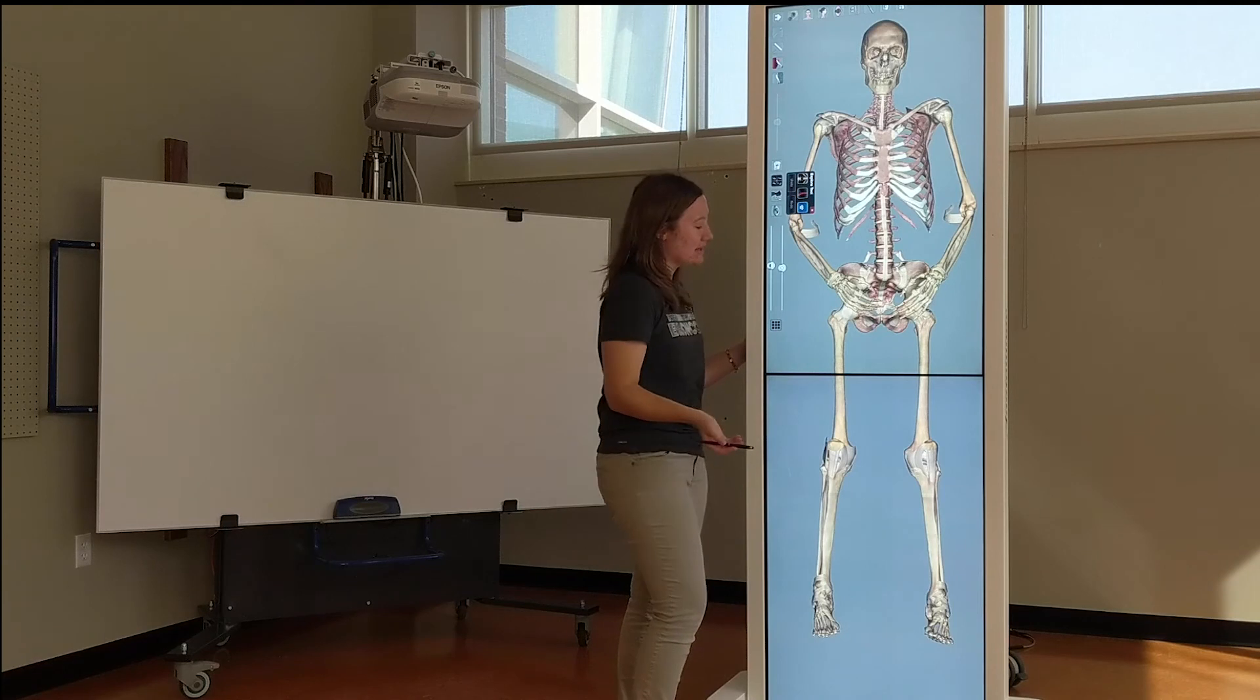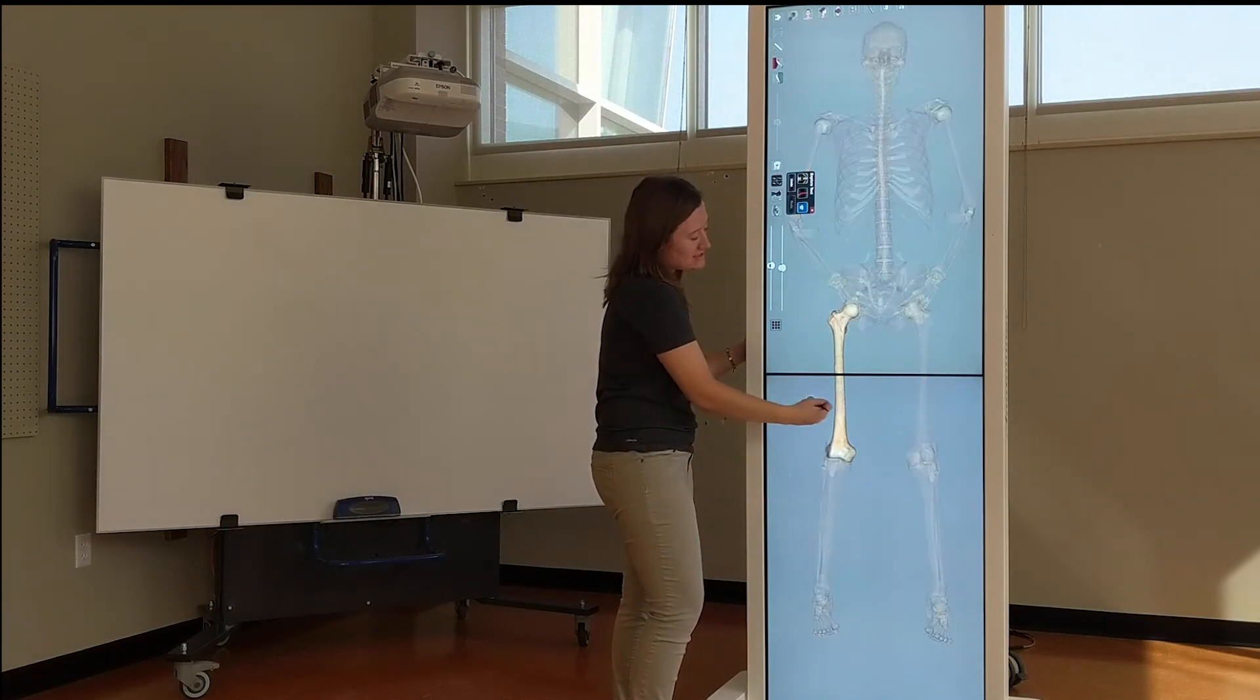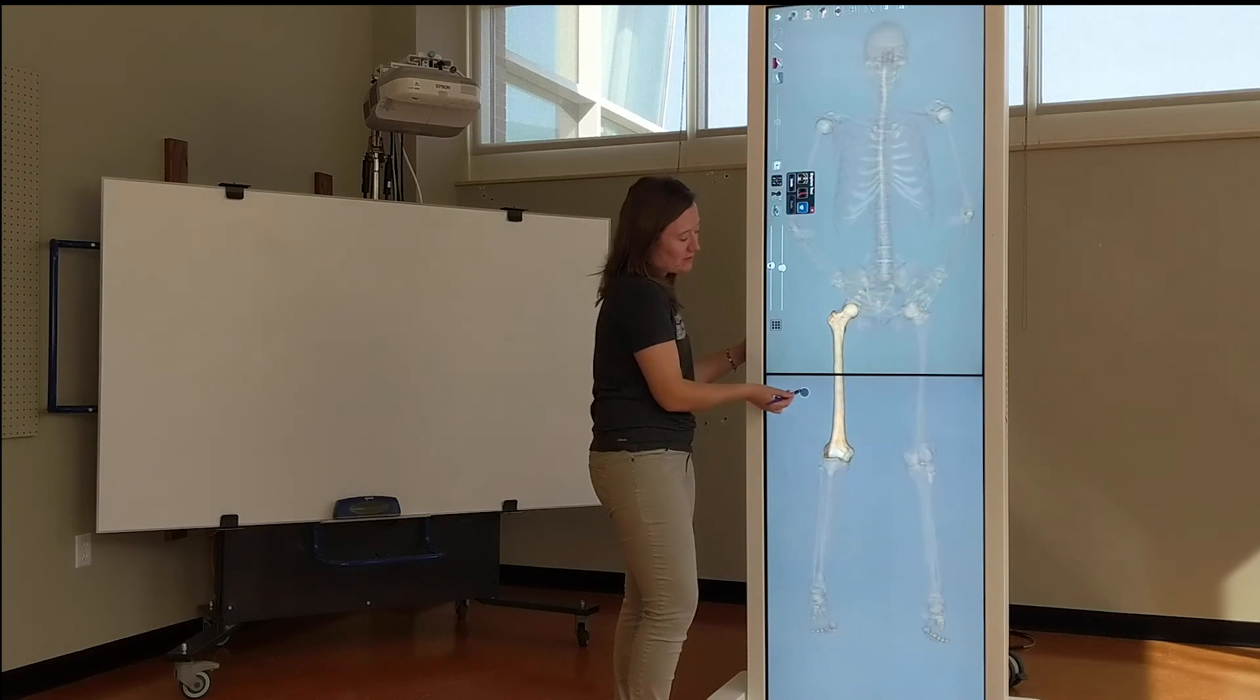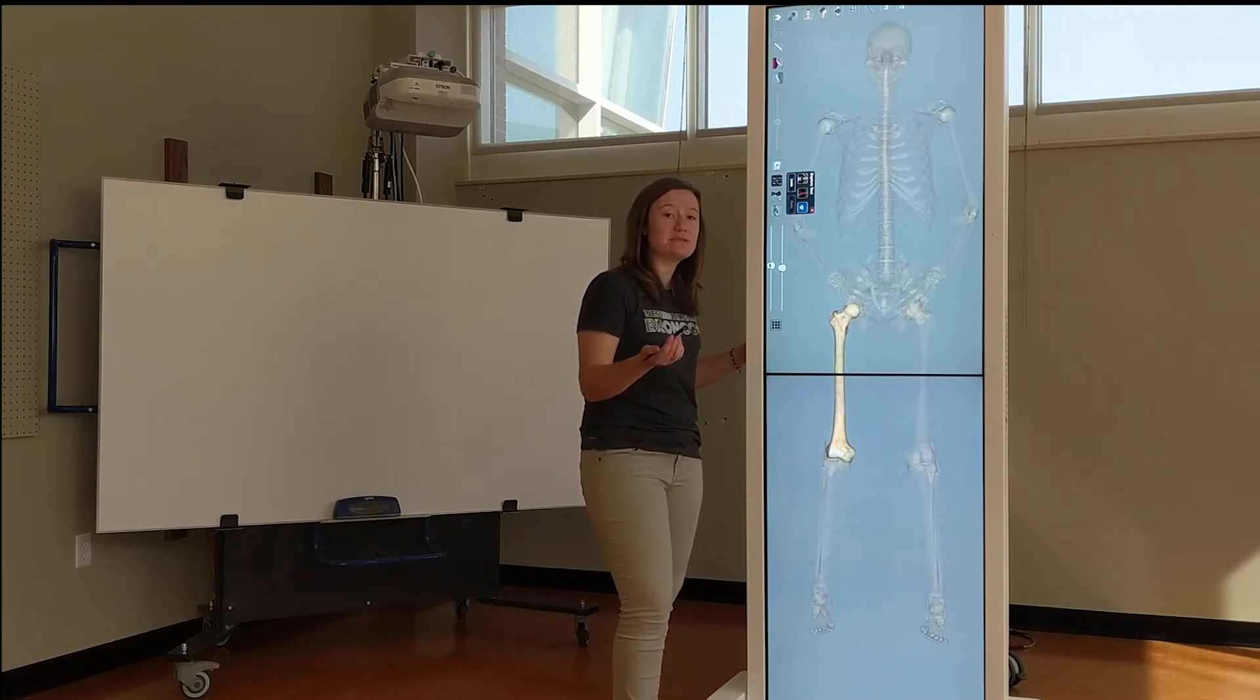And I am going to choose the isolate a bone feature. Here you can see I have isolated the right femur. This can make it easier to study so that you can specifically look at the exact area that you want.